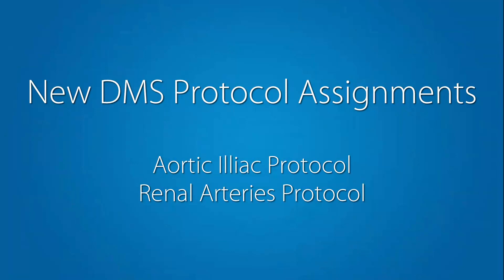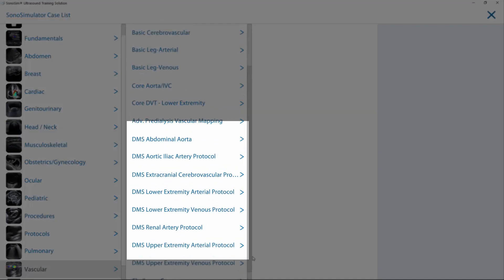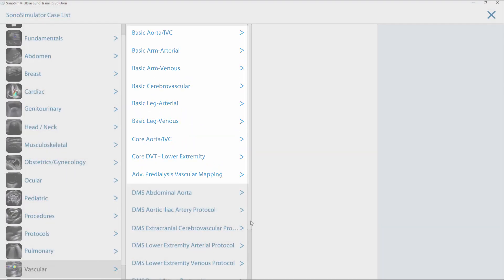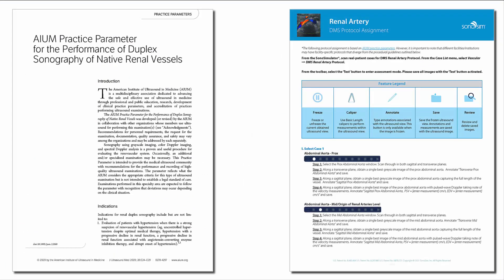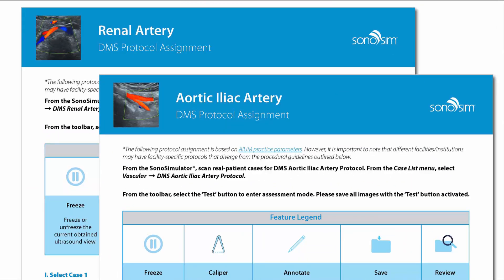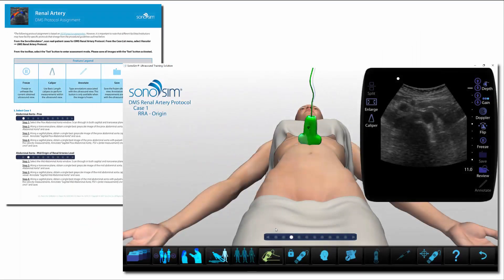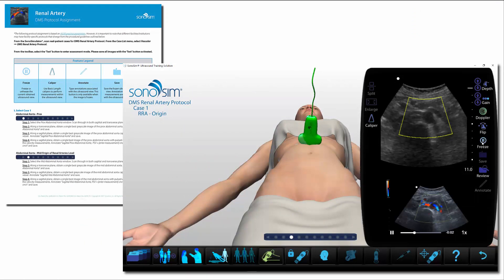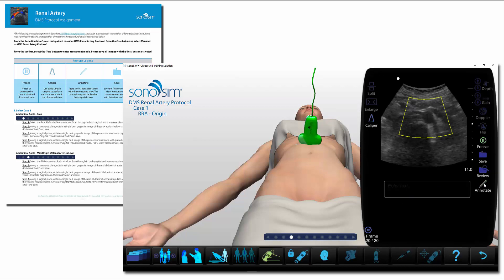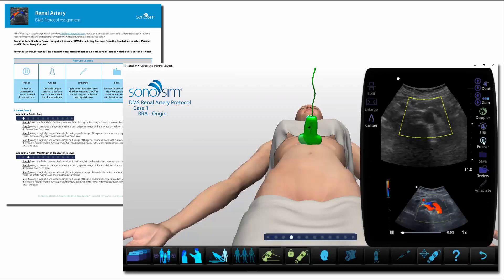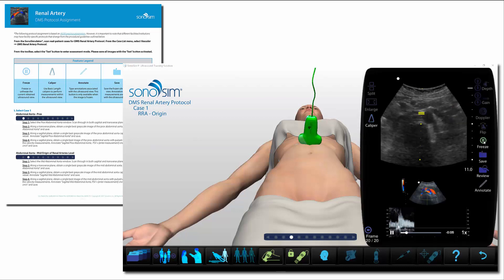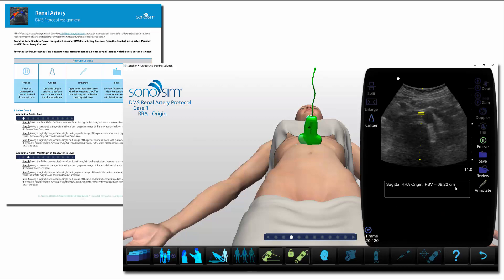This release also includes two new DMS protocol assignments. DMS protocol assignments are standalone scanning cases which complement our Sonosim modules and align with AIOM practice parameters. These cases allow for full execution of diagnostic medical sonography scanning protocols to enable seamless integration into sonography program training curricula. This release introduces specialized vascular protocol examinations with the integration of renal arteries protocol and aortic iliac protocol assignments. As learners work through the protocols, they'll have the benefits of Sonosimulator training features for guidance, gaining practice and confidence to scan these specialized examinations and enter real-world scanning.